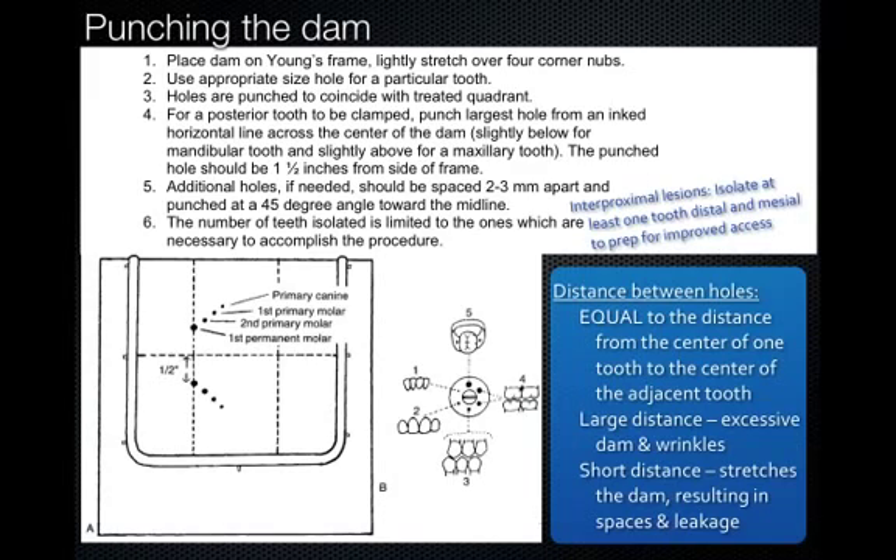Next step is punching the dam. Whenever you're seeing a pediatric patient — be that a 4-year-old to a 14-year-old — everything needs to be ready before we get started, including the dam being on the frame and punched and ready to go. Here are some individual steps on how to punch the dam, which we did go over in the preclinical lab.